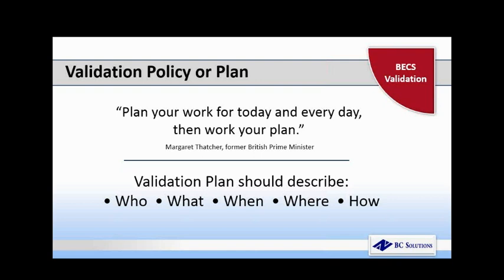So if you have a need for validation coming up, or even before there is any need, you could sit down and complete this validation policy, answering those questions, making those decisions ahead of time, so that you'll be better equipped to handle any validation that comes up. And realize with this, each organization has the ability to determine and define when your validation will be done, what will be done, how it will be performed, who will perform it, and where you store the documentation.